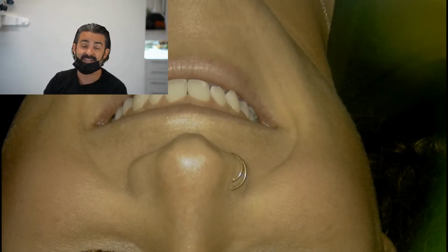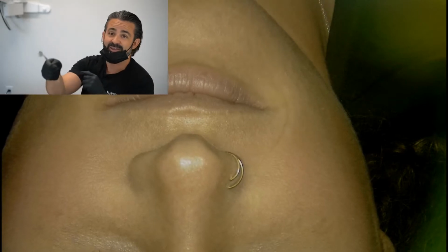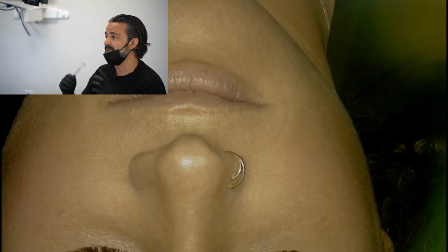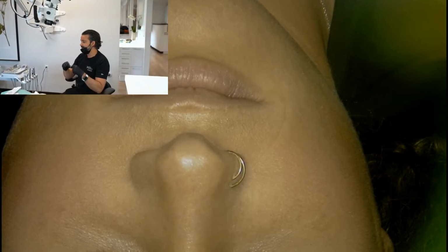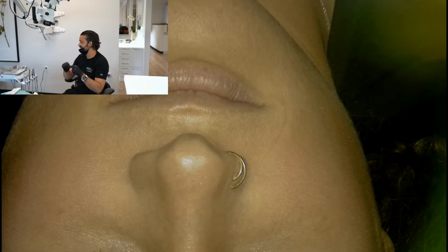Now, disadvantage to that, by the way, point counterpoint is, what if you have a left-handed doctor in the room? And so that's where you would be really defining your space for right-handed, left-handed. Right now, I only have lefty assistants and no lefty doctors in my practice.